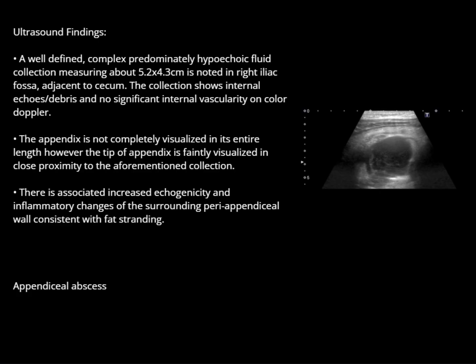The appendix is not completely visualized in its entire length. However, the tip of the appendix is faintly visualized close to the proximity of the aforementioned collection. There is also increased echogenicity and inflammatory changes of the surrounding peri-appendiceal region consistent with fat stranding. And lastly, for impression: appendicular abscess in the right iliac fossa.